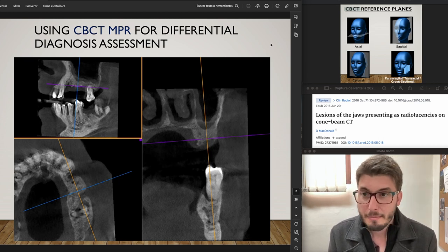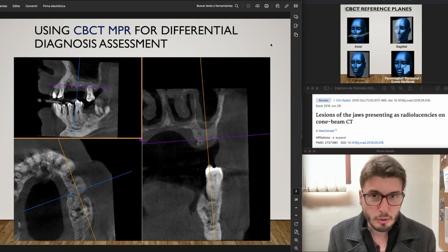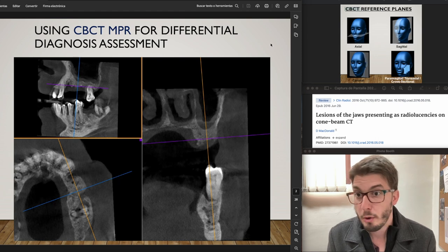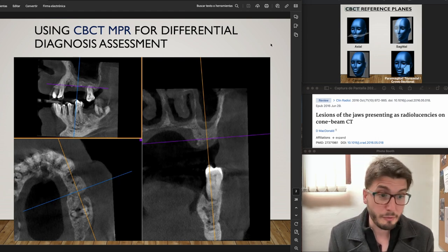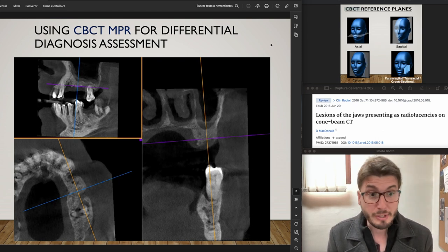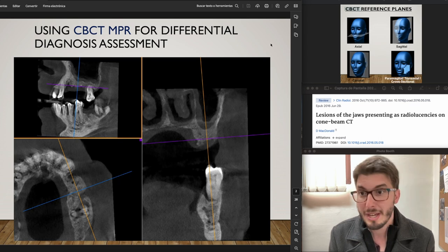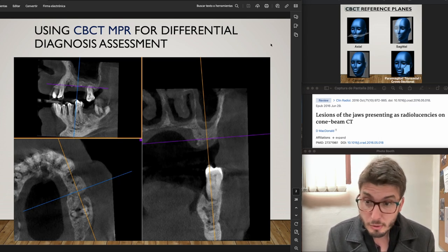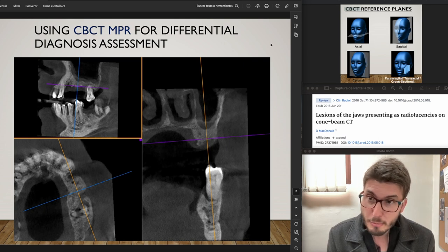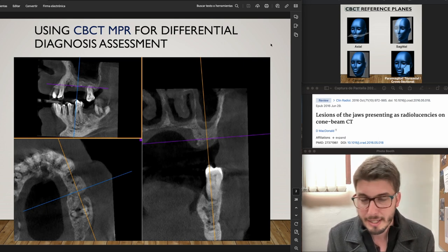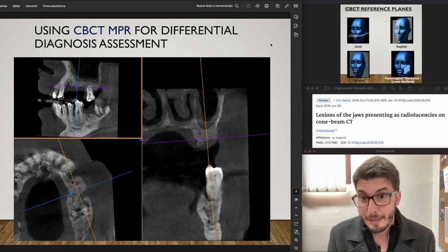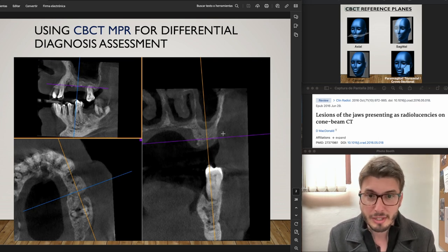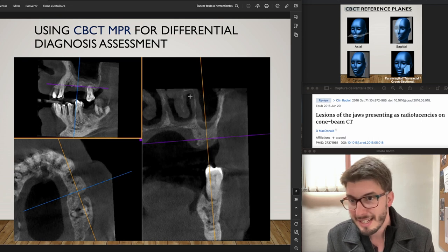Here I am tilting the axis to diagnose the alveolar bone. You can see we have horizontal bone loss — the level of the alveolar crest is decreased due to resorption. We have a large edentulous area, a buccal plate defect on the premolar site, sinus membrane thickening visible in the cross-sectional image.